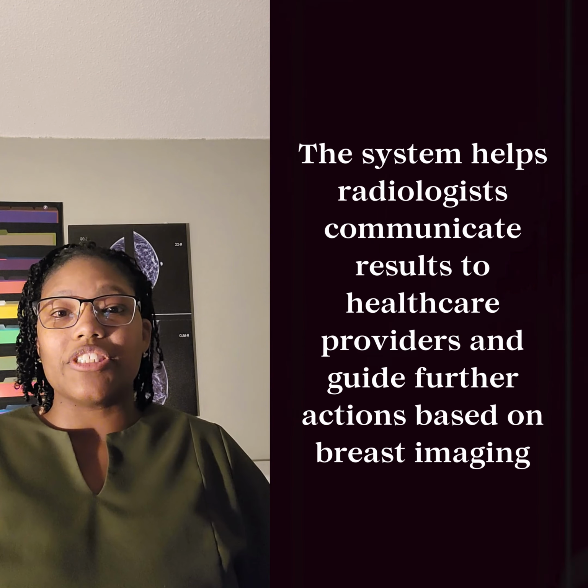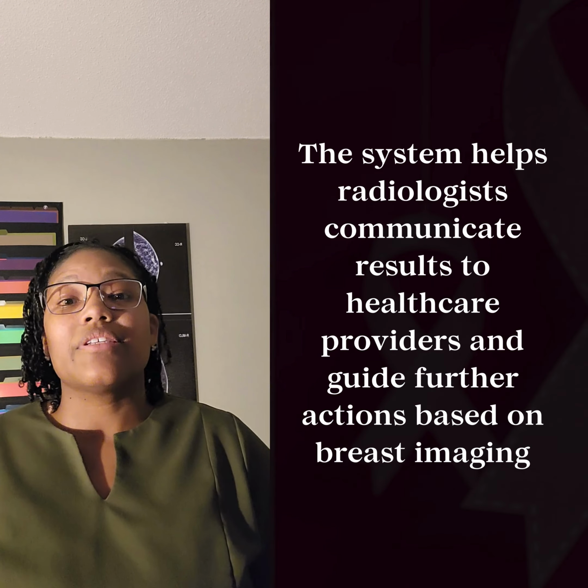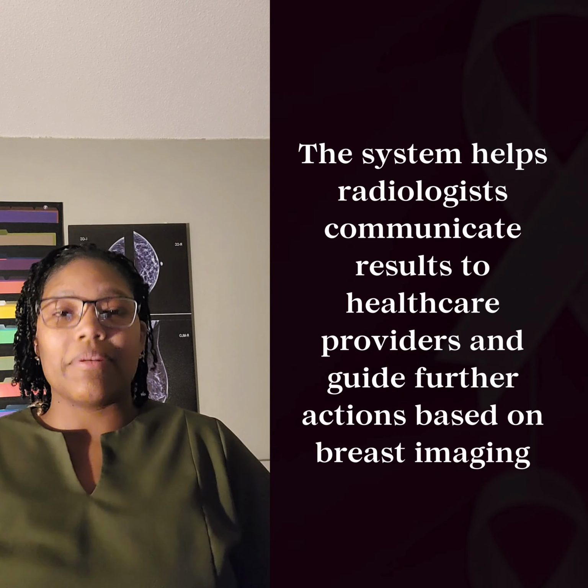So that is how we track your progress throughout your mammograms, and that's how the radiologist communicates with the tech and with your ordering doctor, to let them know, hey, this step needs to be taken, that step needs to be taken. And I do understand that going back and forth for diagnostics can be very time consuming, expensive, frustrating, and scary.